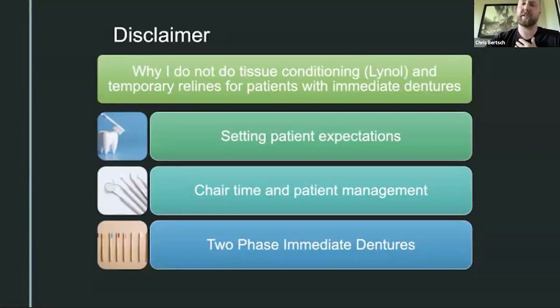The other thing too is with the digital dentures, I find it such a true form and capture of the soft tissue that we aren't needing to do a bunch of adjustments as they're healing, compared to when I would do alginate and custom trays. The borders would overextend, and it just seemed like way more sore spots, versus now it's much less and not much of a thing at all.